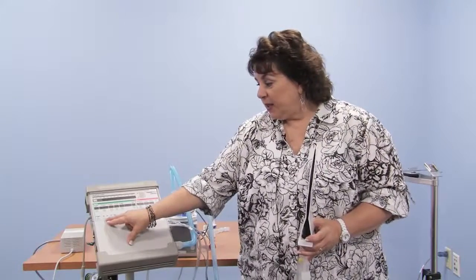If our child's getting breaths by the machine, mandatory breaths, like for example 8 breaths a minute delivered to your child, are they going to be the kind of breath where we set the actual tidal volume that's delivered to them, or are we going to set a pressure that is achieved in the lungs? All of these numbers are prescribed by doctor's order. These are things that you'll learn before you go home from the hospital. These are things, if you're at home, you'll learn before your child goes onto the device. So these are numbers that are pre-established and applied to the machine.